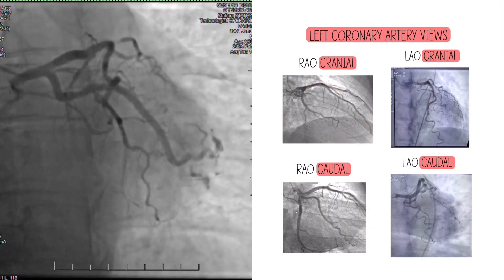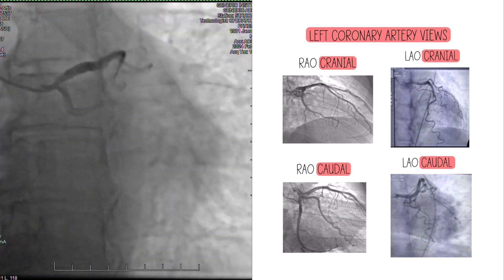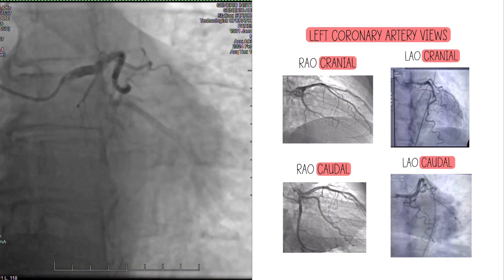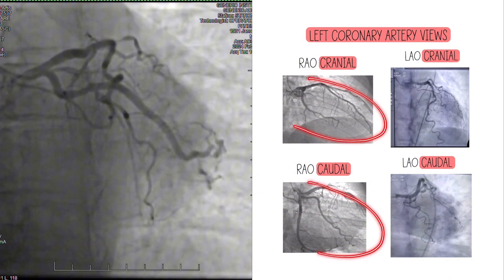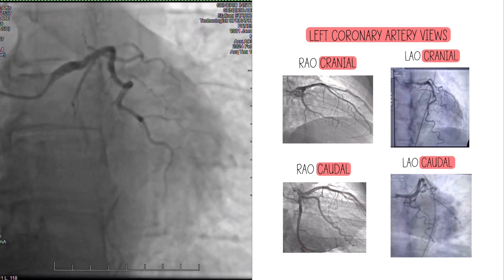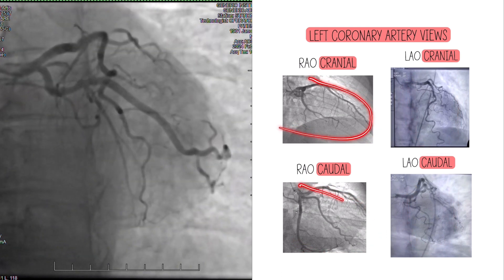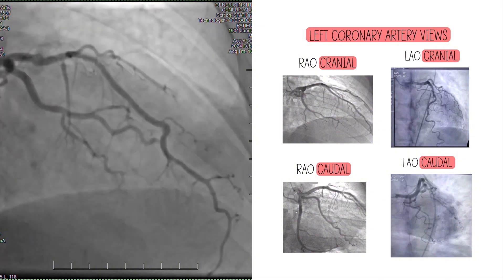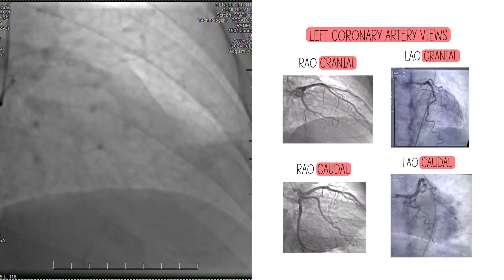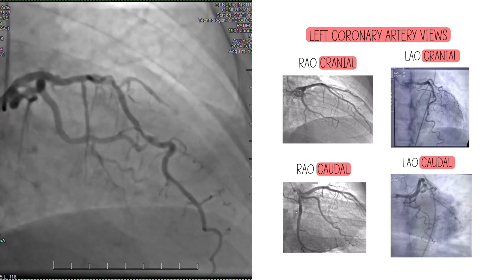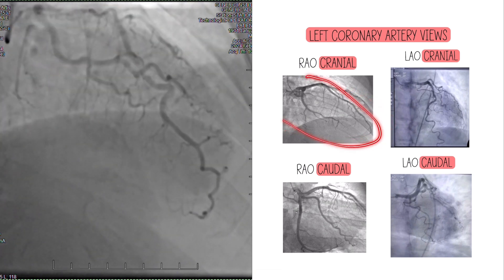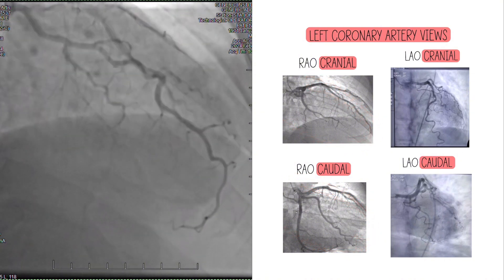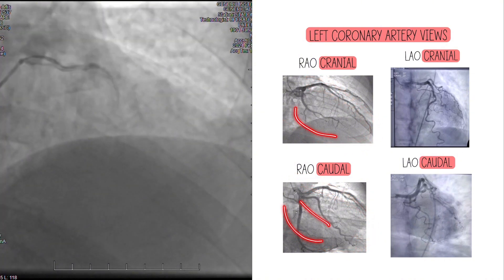The way I personally look at views is I try to step back and look at the heart shadow. RAO cranial has more of an oblong elongated shape, and LAO cranial has more of a down oval football shape. When you get familiar with those, you'll know where the walls of the heart are and then you can figure out the arteries. In RAO cranial, the LAD runs along the anterior wall, which is the top, the inferior wall is here, and the lateral wall is kind of in the middle.